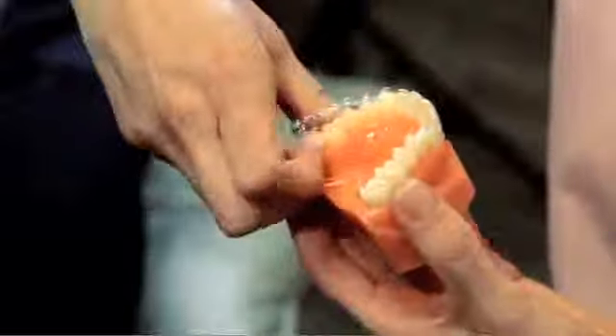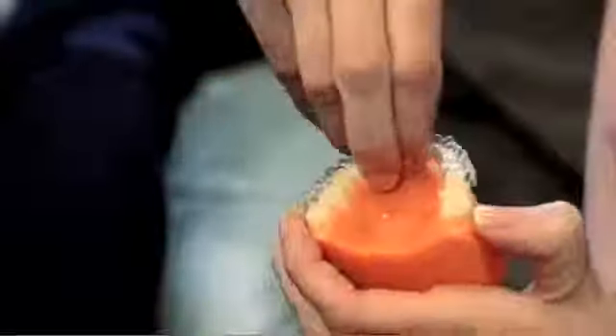To remove the aligner, simply place your fingers on the inside of the brace at the back of your mouth and pull the aligner down. Come to the front of the brace and use your fingers in a pinching motion to pull the aligner down.